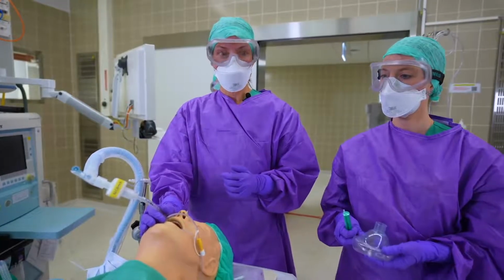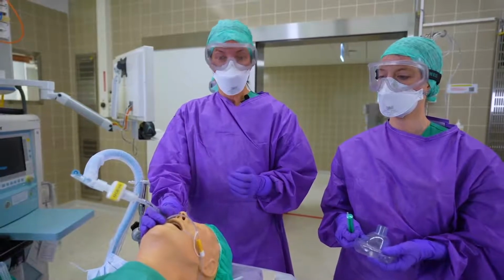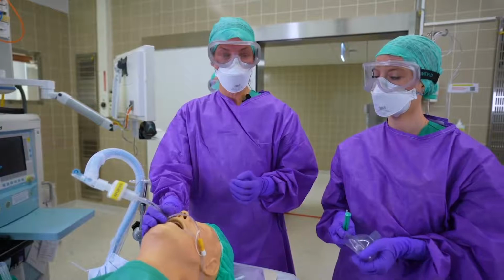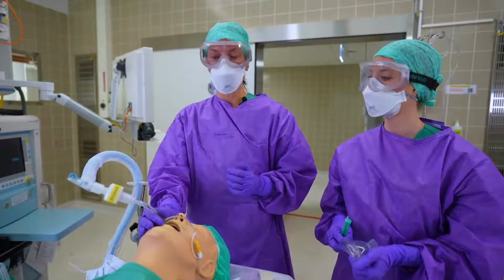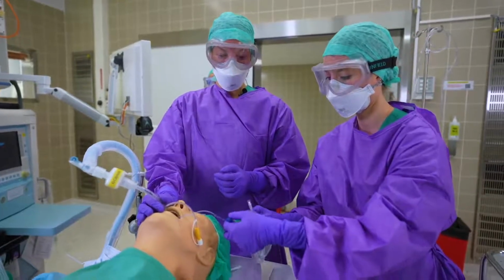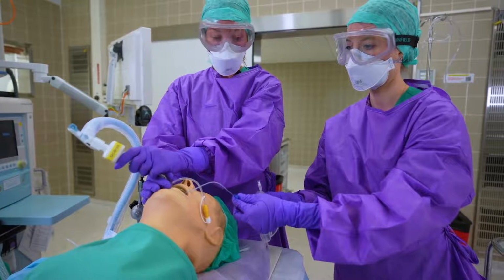It is important to avoid coughing when you extubate the patient. Here, IV lidocaine or remifentanil come in handy. When you extubate, you're not utilizing positive pressure, but rather you're deflating the cuff and pulling the tube.